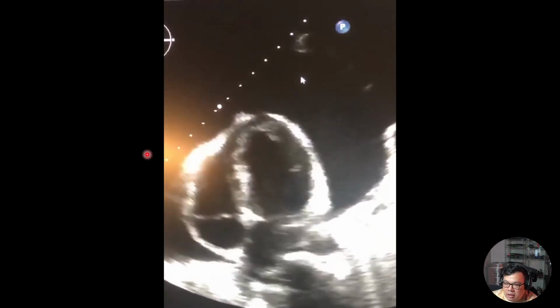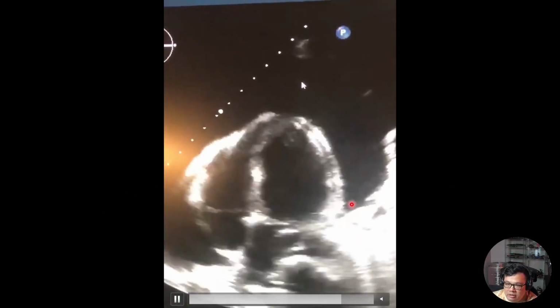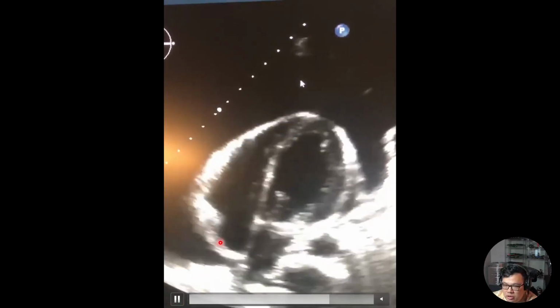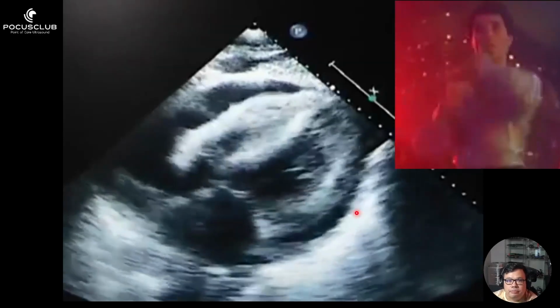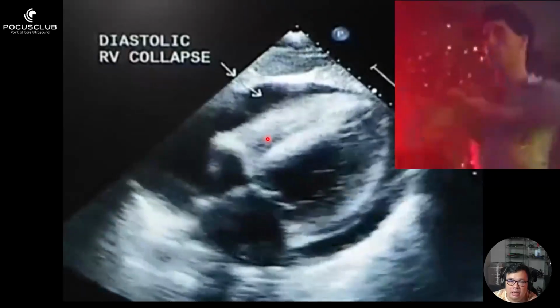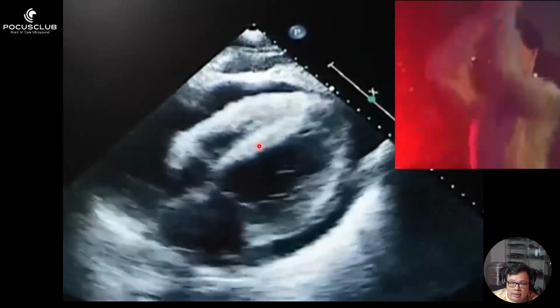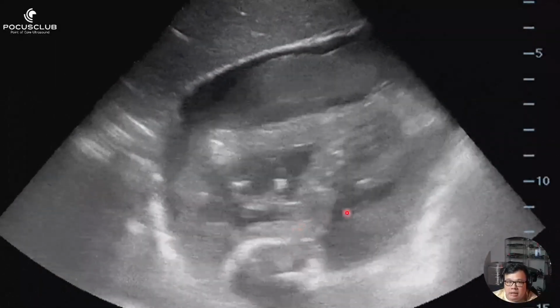Over here, if you had an ECG, you'd see electrical alternans because the heart is shifting from left to right. Again, you can see impaired filling of the right atrium. In this patient, you would be very suspicious of impending pericardial tamponade if he's not shocked already. If you don't know what it looks like or cannot recognize tamponade, if the right ventricular free wall is doing the John Travolta on you, that is likely pericardial tamponade, and the heart is not going to be able to fill properly.